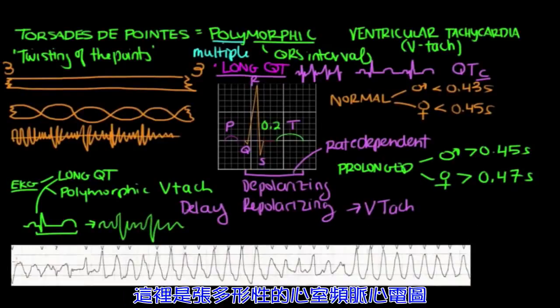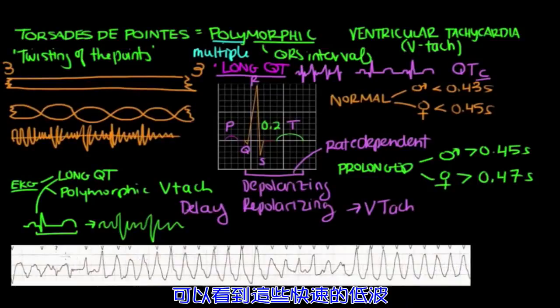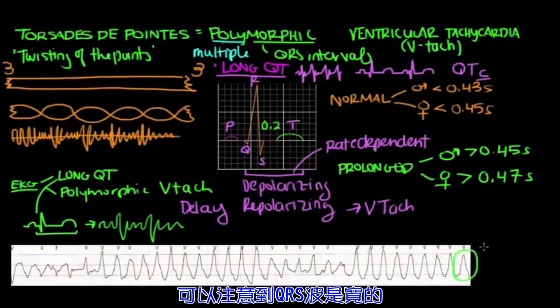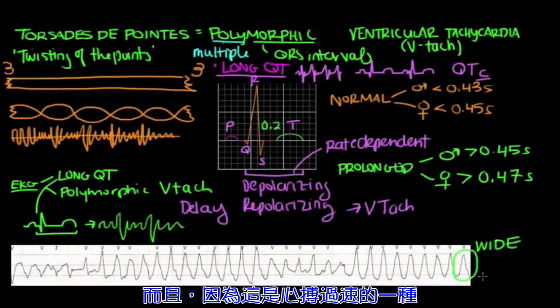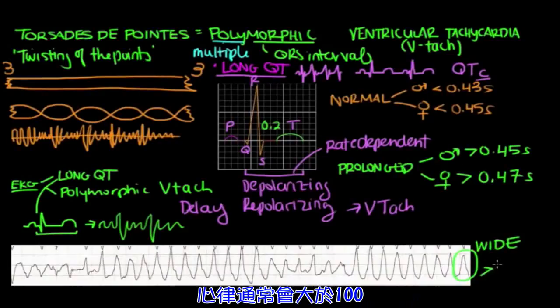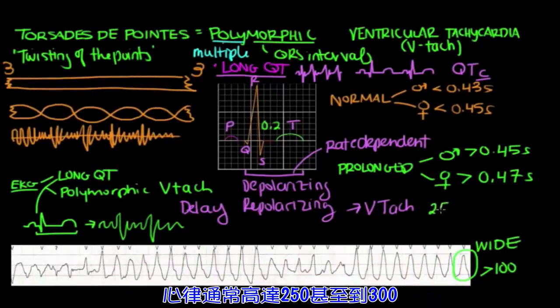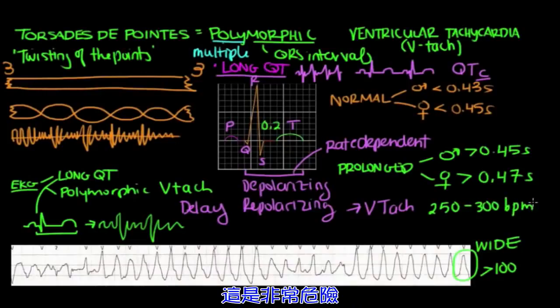Here is an EKG of someone with polymorphic V-tach. You have these short-amplitude waves, followed by these large-amplitude QRSs, and then short again, and then large-amplitude. You notice that the QRSs are wide complexes. And, because of the tachycardia, the heart rate is greater than 100.